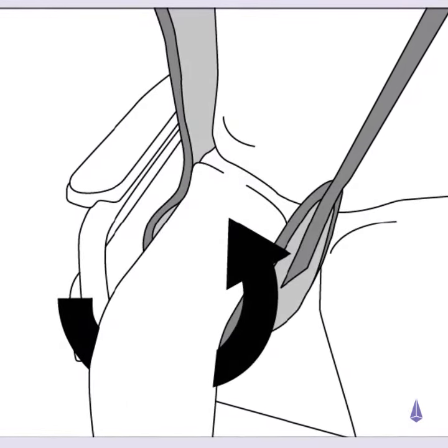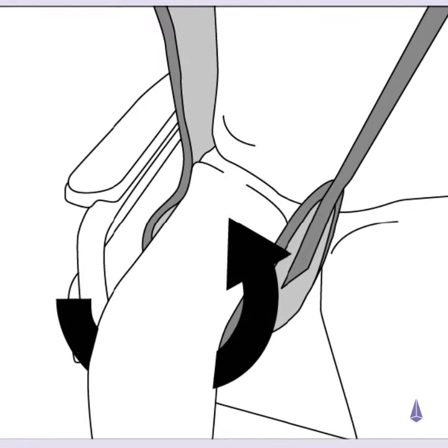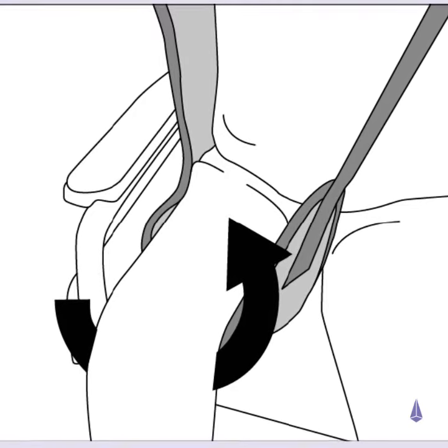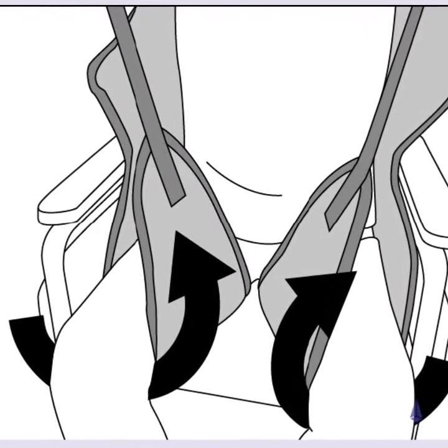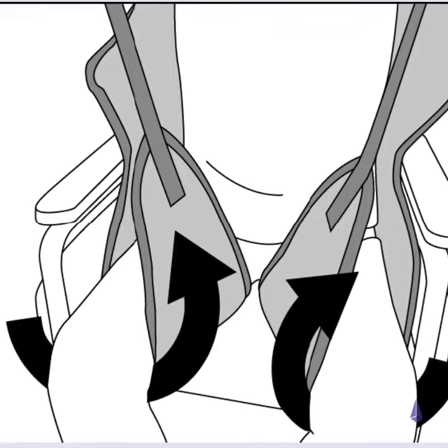Take one leg section, place it down the side, and glide it fully under the thigh, ensuring that it is not twisted. Repeat on the other side and ensure that the sling is not twisted.